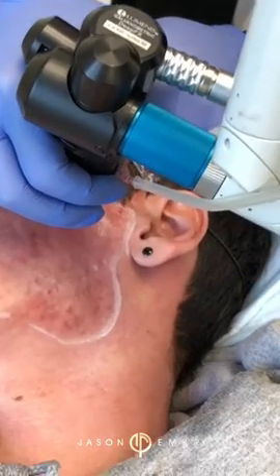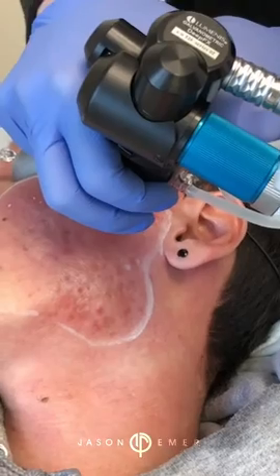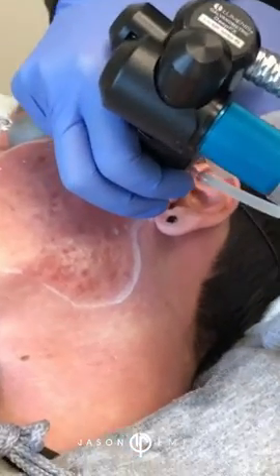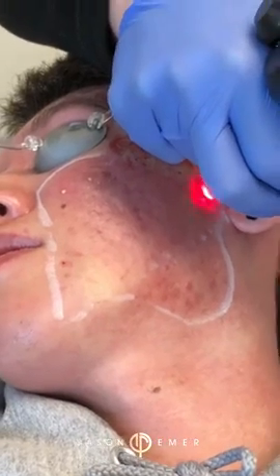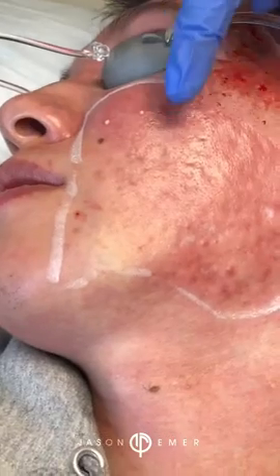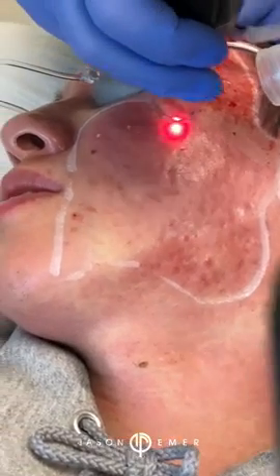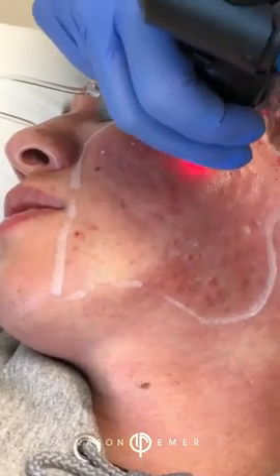Michael, how are you doing? Did you remove the TCA before the CO2? You do not. You leave the TCA on the skin. So you treat that first. So you keep it on, guys. So you can see right here, for those that are tuning in, this is where we did our TCA. That is the clinical endpoint. We want a nice frosting. We're going to go over it with the CO2 because right now we're treating a little bit more of the surface of the skin.